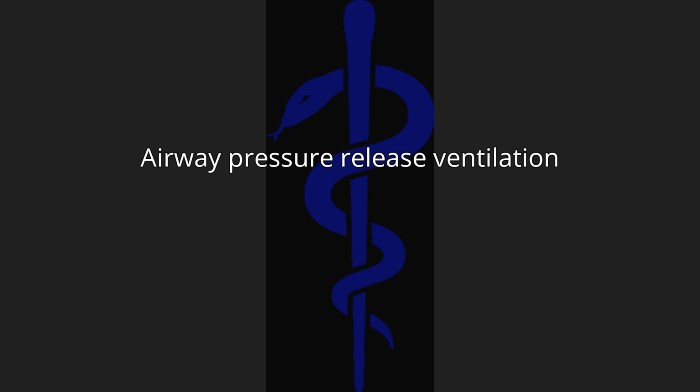APRV is currently the most efficient conventional mode for lung protective ventilation. Different perceptions of this mode may exist around the globe. While APRV is common to users in North America, a very similar mode, biphasic positive airway pressure, BiPAP, was introduced in Europe. The term APRV has also been used in American journals where, from the ventilation characteristics, BiPAP would have been perfectly good terminology. But BiPAP is a trademark for a non-invasive ventilation mode in a specific ventilator, Respironics Inc.